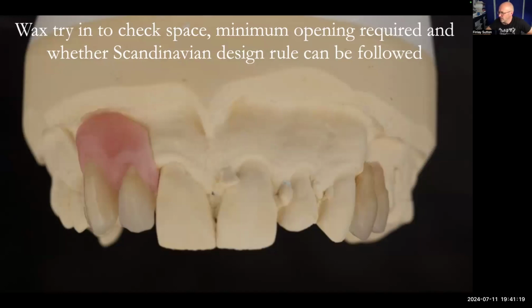I'm going to just have a quick look at the chat there. Mustafa has asked a question about, with regards to the upper right one, could a milled crown not have worked given the tooth is root treated, or is it too conservative an approach? Mustafa, I do think it would work, but it would add another maybe £1,000 or so to the treatment plan. And also, there's a very high chance that this root treated tooth would have fractured in the future, and then we would need to add it onto the denture, which would have been possible with backings. So that's why I didn't think of doing that, just purely because of cost.